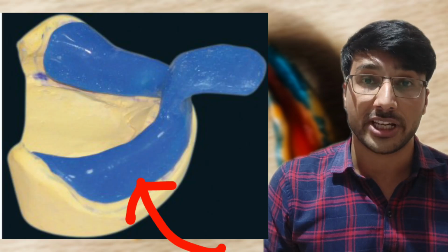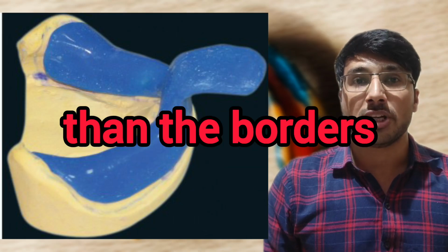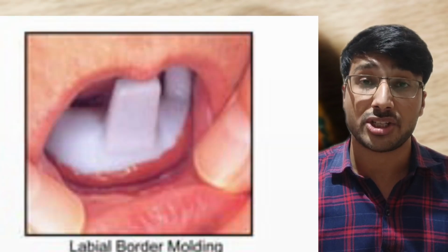Your custom tray is very important because most of the time our custom trays are overextended. So it must be 2 mm shorter than the borders in the primary cast. We will check the extension in the patient also.